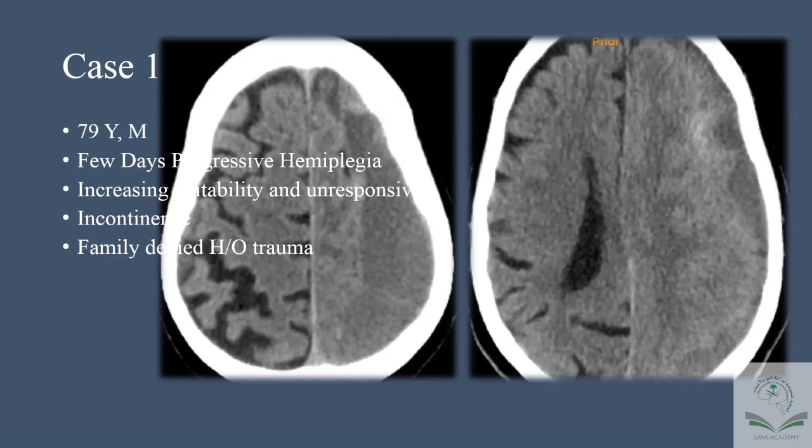I'll just be more careful when I open the skin, so he doesn't track some bleeding from the skin and galea down to the borehole cavity. And I will make sure that I put a gel foam after I finish. Just be more meticulous with my hemostasis in this case. Excellent. So it is the same as even if he wasn't on aspirin.